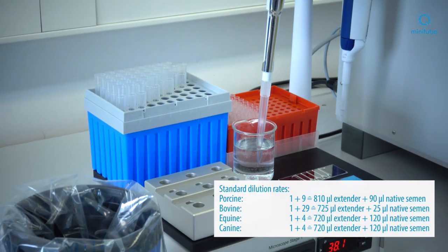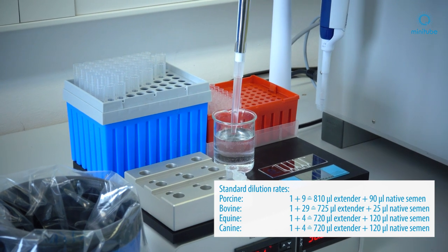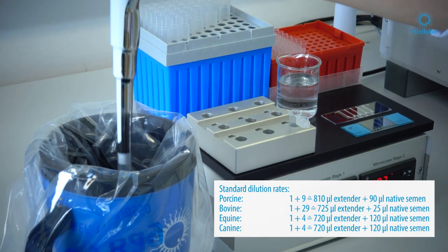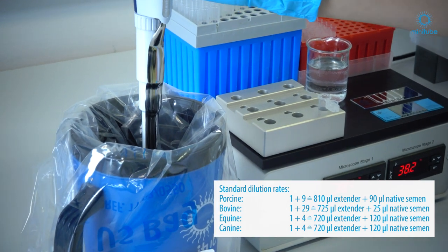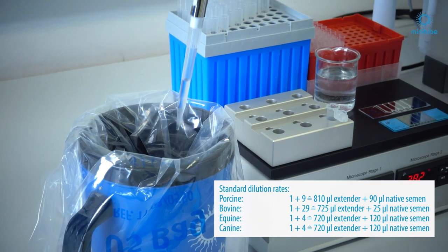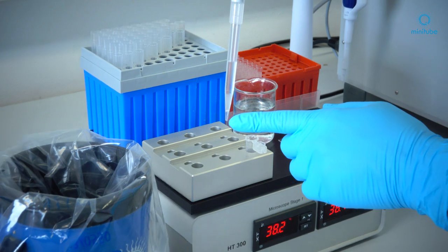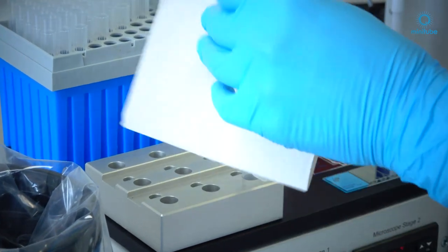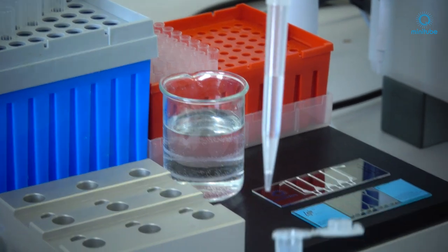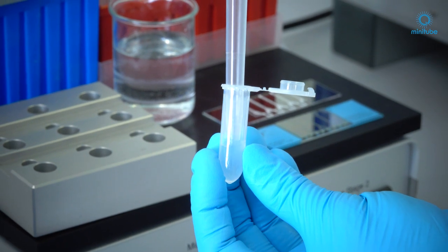First step is 810 microliters of extender. Then you go directly into the mixed ejaculate and take 90 microliters of native semen, and then 20 microliters of air to wipe the tip before you mix the sample into an empty and pre-warmed cup.